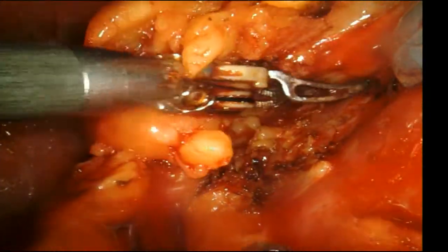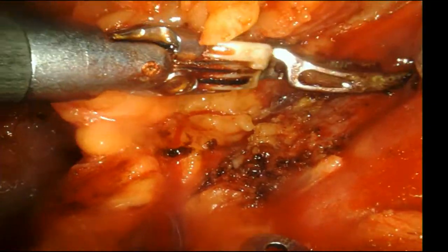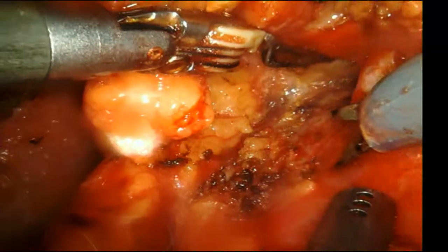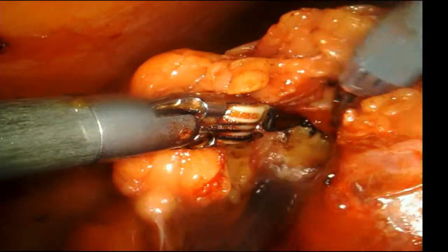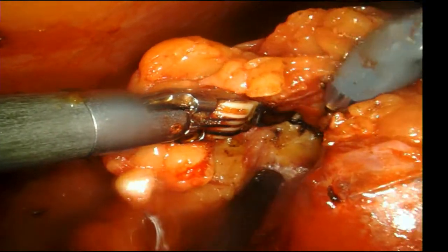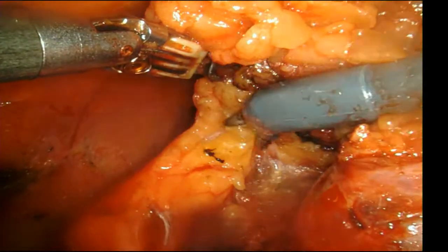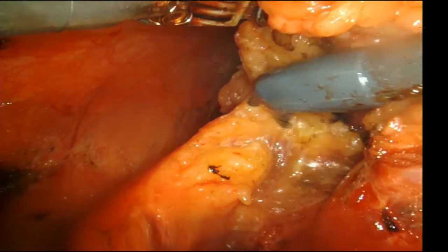So Ryan, I had a question. Obviously using the Xi here, do you typically target, and where do you typically target at the beginning of the case? Yeah, I don't use that targeting feature. I never figured it out. They tried to teach me how to use it when the Xi first came out, and I couldn't figure it out, so I gave up. Yeah, I agree with you. I don't think it really added any benefit.